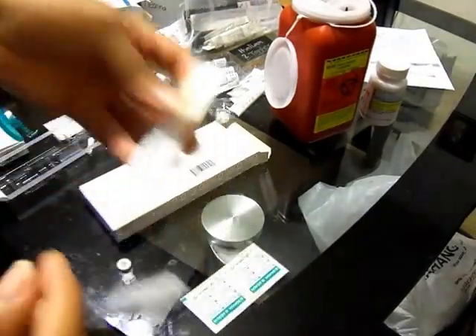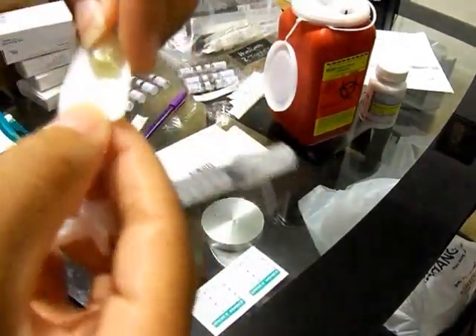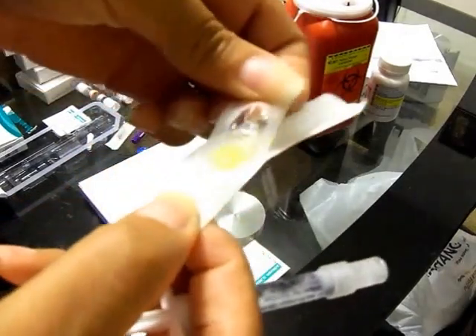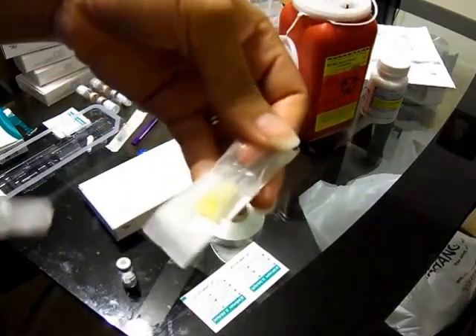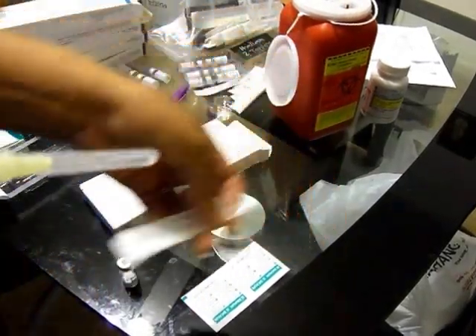Then you take your mixing needle, and it has tabs here. You just separate them and pull it back a little. I just hold it like this, and stick it on, and twist it on, and pull it out.